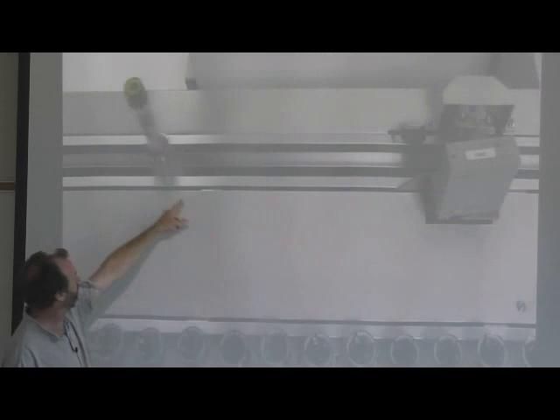So there's your sample. It's being loaded, and if you notice, it's getting dark. The scanner right there is reading the barcode. Ladies and gentlemen, this is the future of your job. I'm sorry, the life of your job. And then it's going to be sorted to go to whatever machine it needs to go, right? This is on the centrifuge rack, so these ones are going to be centrifuged.